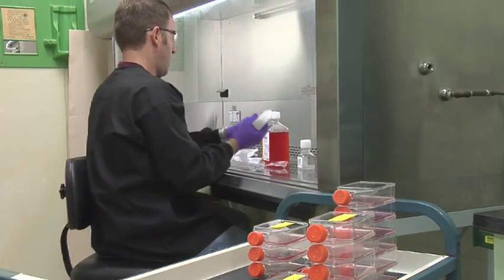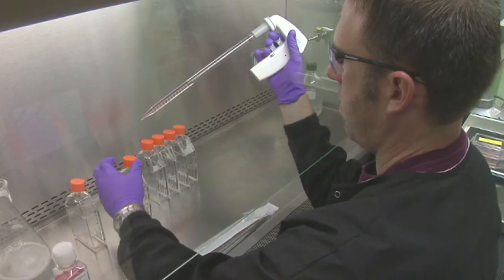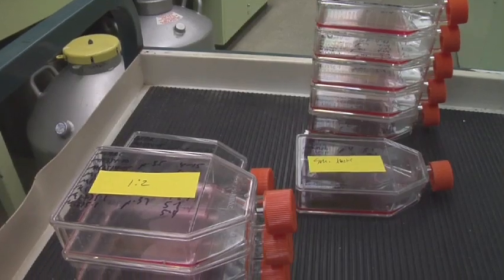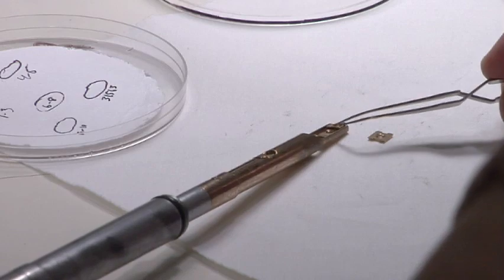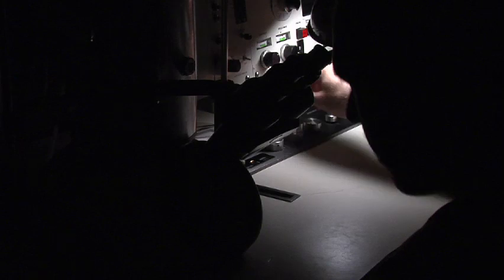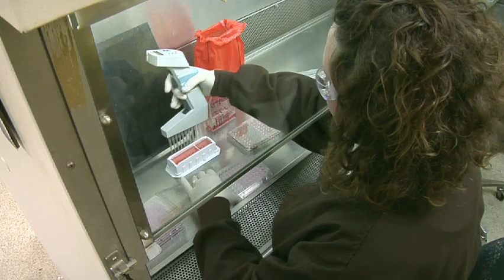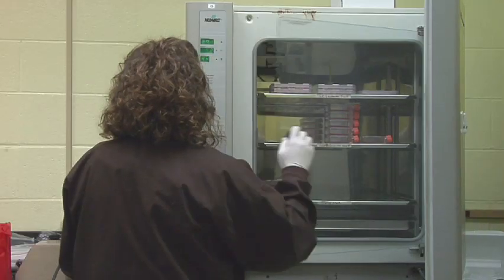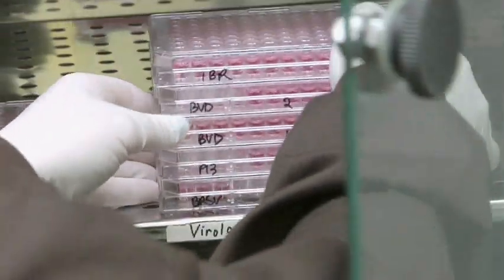The virology section offers the diagnosis of viral antigens and antibodies. The lab investigates cases using cell culture systems and electron microscopy. In the microbiology world now, it's not one virus equals one specific presentation of a disease. Our job really is to at least provide a portion of the diagnosis so we can get a more complete picture to the client. The virology lab is one of the few to run an antibody assay for porcine circovirus used for the verification of vaccination.